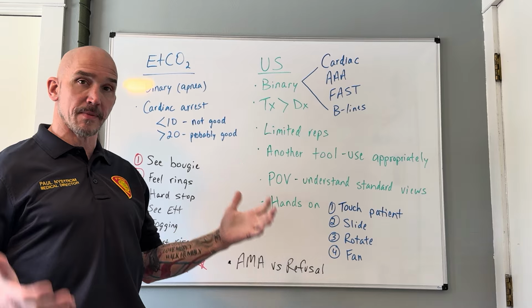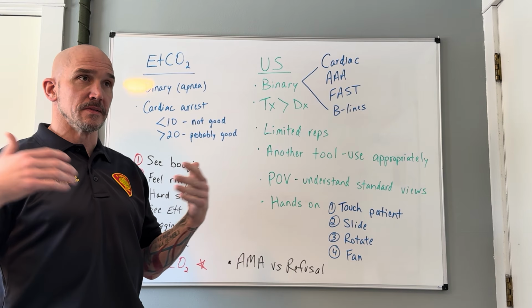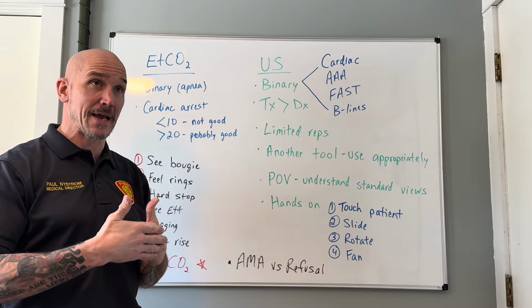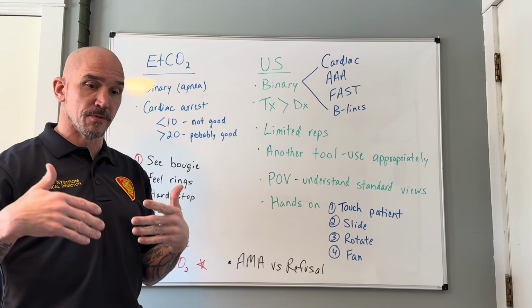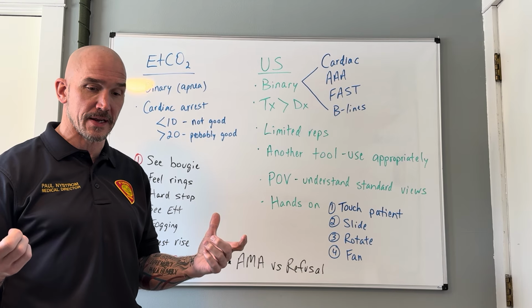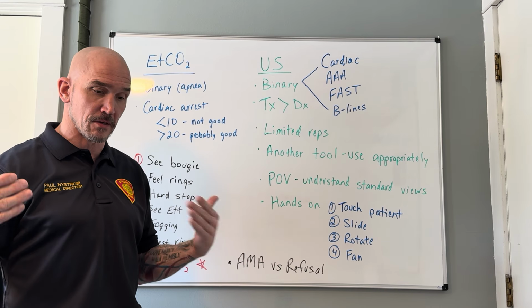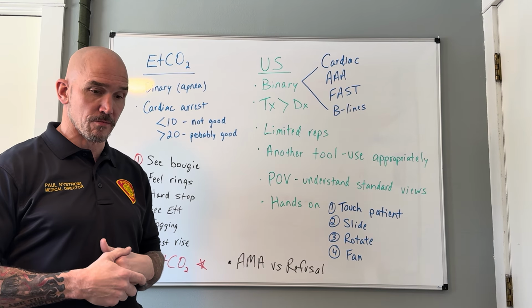Again, there's some debate about like in sepsis or DKA, and there's some numbers in the paper from some studies. There's specific numbers, like a low end-tidal correlates with low pH and high lactate. But again, they're in the discussion part of the paper, and it says more studies are needed. So I don't have anything that I think we should put in writing or in a policy. Again, you can dig into it more for yourself and use your critical thinking, but it's not a magic thing. I don't think it's something that we need to actually put in writing anywhere. But again, you can look at that in more detail.